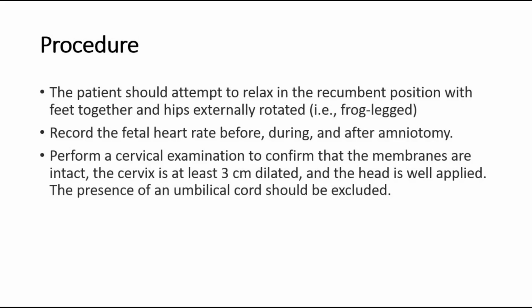So for the procedure, before starting, the patient should be in a relaxed recumbent position with feet together and hips externally rotated, like a frog-legged position. Before, during, and after the procedure, record the fetal heart rate to make sure there is no fetal distress or other problems. Perform a cervical examination to confirm that the membranes are still intact, the cervix is at least 3 cm dilated, and the head is well applied. Also exclude the presence of an umbilical cord.